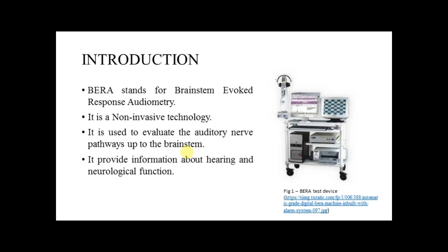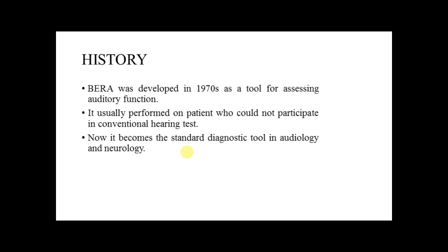Here is the BERA test device which is being used for this experiment. Next is the history of the BERA. BERA was developed in the 1970s as a tool for assessing auditory function. It is usually performed on patients who cannot participate in conventional hearing tests. Now it has become the standard diagnostic tool in audiology and neurology.